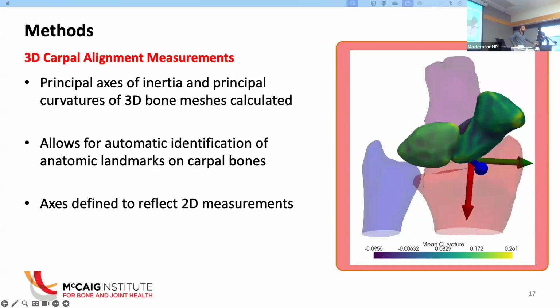So overall, you're not really too worried about the viability of weight bearing CT for these individuals, pain wise? I don't think so. Once we understand this, hopefully we can get people into a level of extension that they're comfortable with. Maybe in the future, we could use a more vertical position, pushing up against the wall, and see if that's more comfortable for them. But for the most part, the fact that they were able to do it with that foam pad, I think there is a bit of viability in using this as a tool for weight bearing CT.